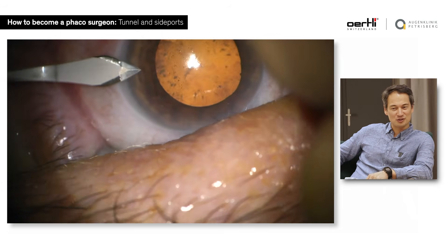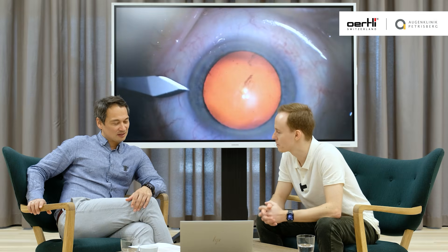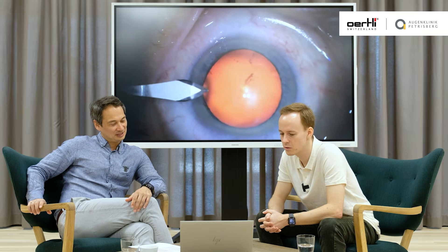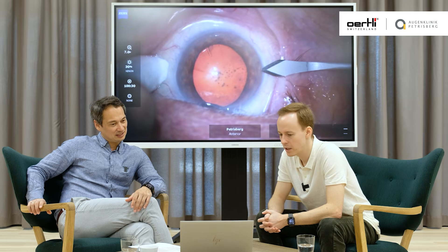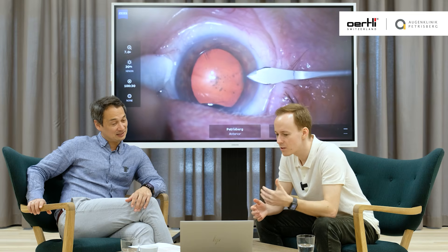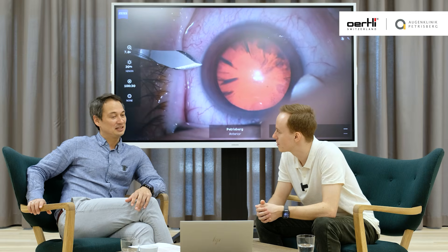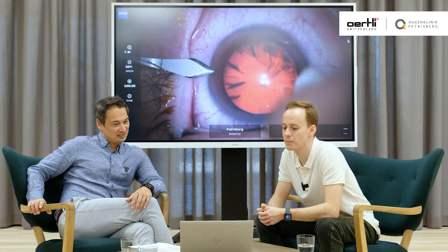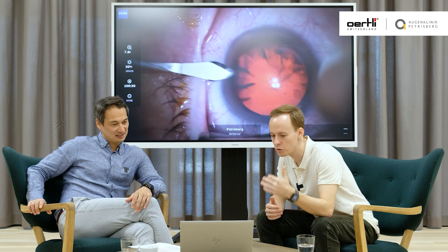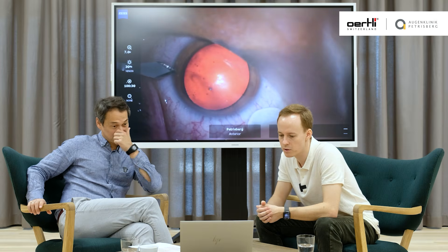This is a decentralized vision — another problem. Sometimes it's still now a problem, but you learn to center the scope better. Every incision looks different here, which is a problem — you need to be standardized. It's really hard in the beginning not to go too much clear cornea and not to go too much towards the limbus.